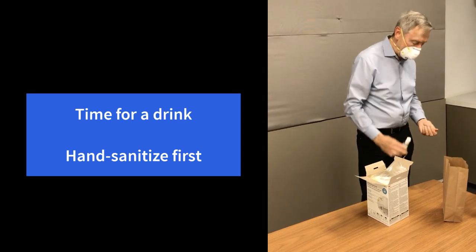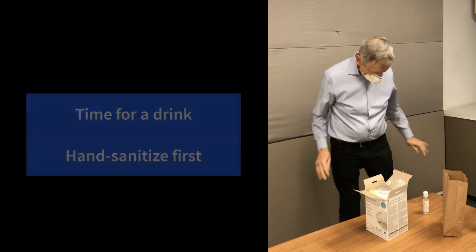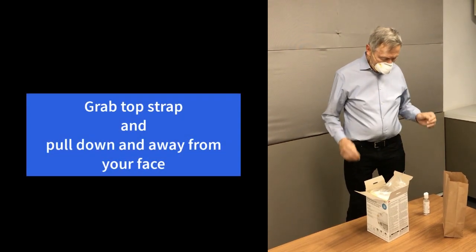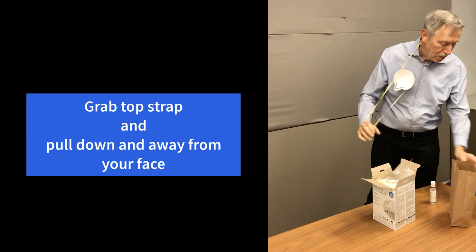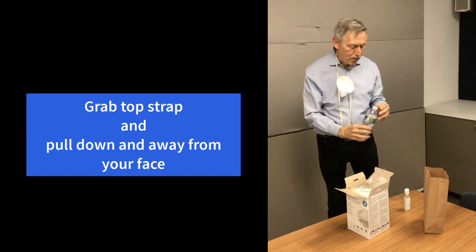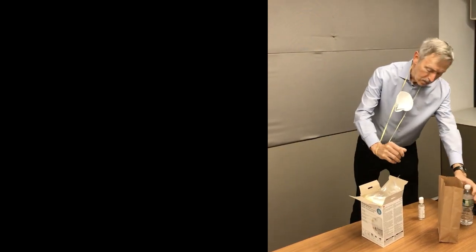Now let's say he has to take a drink. He's going to hand sanitize again, and taking a drink of water during the day, grab it from the top straps, and notice how he's going to pull it away from his face and then take a drink of water. The contamination is away from him. He'll take a drink of water, puts it down, and now he's going to put the top strap back over the crown of his head, making sure the fit is appropriate. He did hand sanitize, so he can go ahead and adjust his mask.